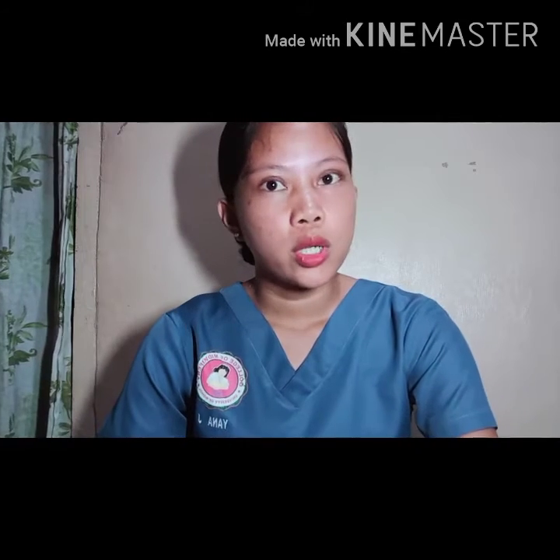Next, you do a patient assessment and psychological preparation. It is important to also prepare the patient for the procedure. After you gather your equipment, explain what you are going to do, introduce yourself, and verify the client's identity, provide privacy, and gain consent.